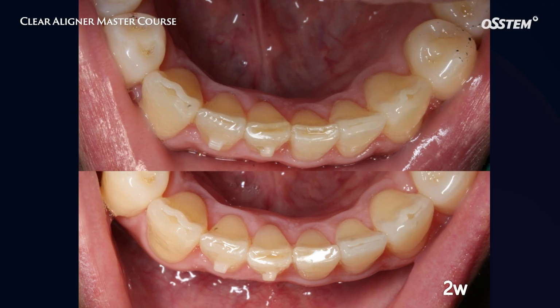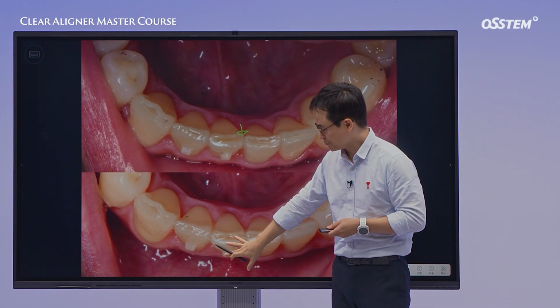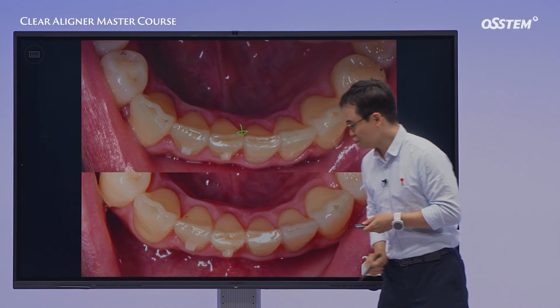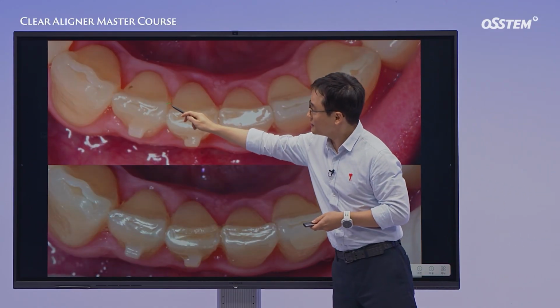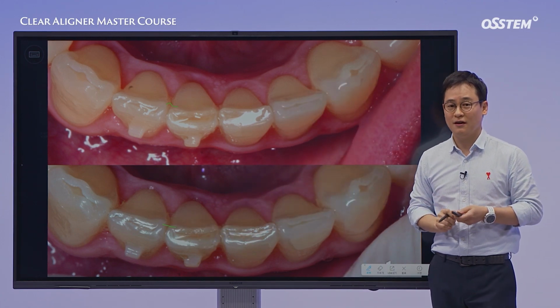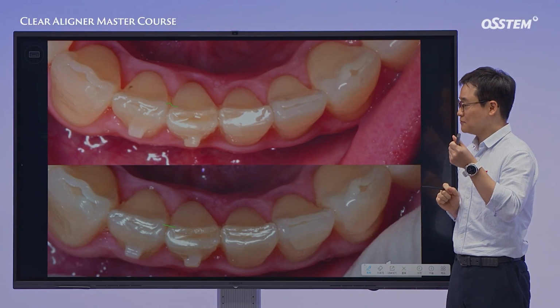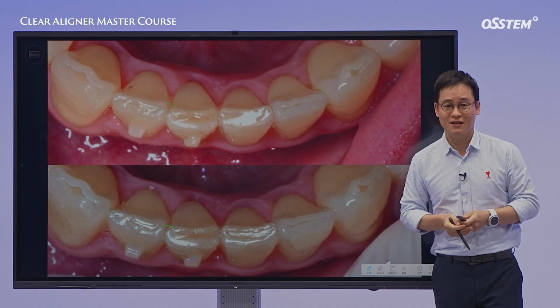After creating the convex bend, a 2-week follow-up showed significant improvement. Due to existing attachments, I initially applied force to the lingual side first. While it would have been ideal to apply force to the buccal side as well, I simply left it with the lingual adjustment for a week, and that was enough to resolve the discrepancy. The entire issue was settled within 2 to 3 weeks. I believe this technique using dedicated pliers will be very useful in your practice.